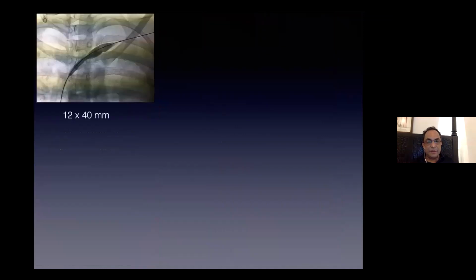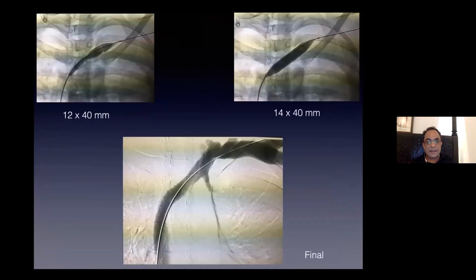So back end of Terumo, and then we do an angioplasty, and then it's a good result. Now here, for example, there is a single collateral that is still showing. So this is an argument to maybe consider doing a bigger balloon. Maybe we have done a 14. First time we don't go to 16, but if it was the second time, I would go to 16.